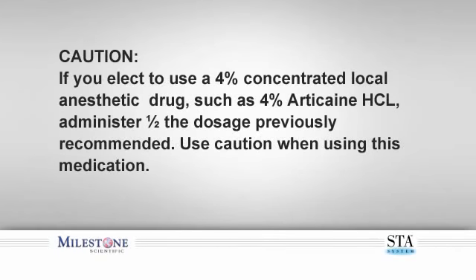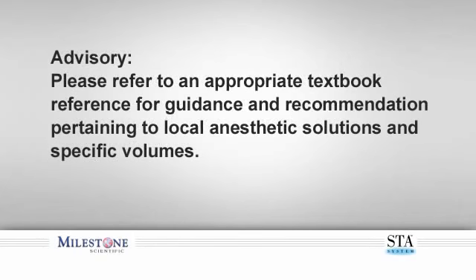If you elect to use a 4% concentrated local anesthetic drug, such as 4% articaine HCl, use half the dosage previously suggested and use extreme caution when using these medications. Please refer to an appropriate textbook reference source for guidance and recommendation pertaining to local anesthetic solutions and specific volumes. Buccal infiltrations can be easily and comfortably administered using the STA's normal mode with both the control flow and rapid flow rates.